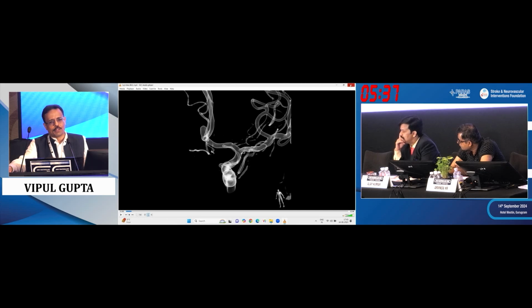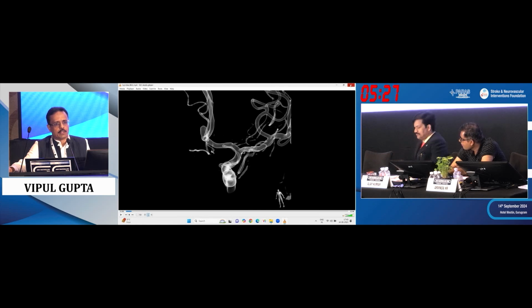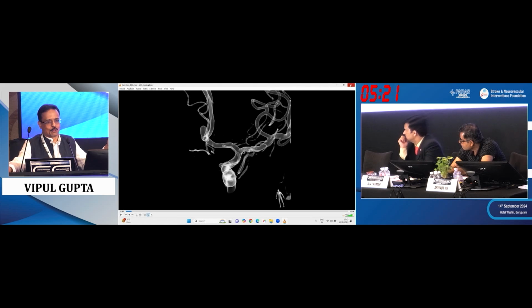We have lots of videos showing different shapes and how to catheterize, but we don't have time for it here. Yes, I think shaping is very important. As I said, in 95% of cases in ruptured aneurysms, we never wire the aneurysm; we just use the shape to enter. Only ICA bifurcation aneurysms you have to wire. A1 ACA posteriorly pointing, you have to wire a bit to catheterize. So there are very few aneurysms in particular locations that we need to wire a bit. Otherwise, most aneurysms you can enter just by the shape.